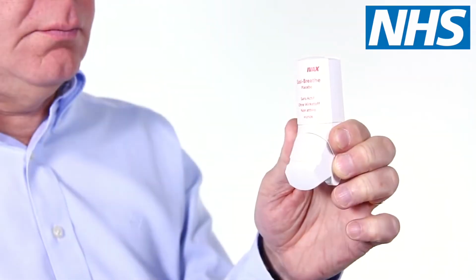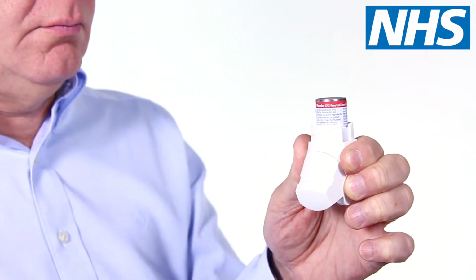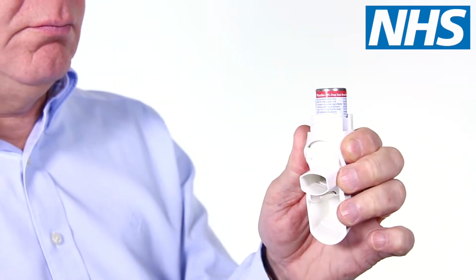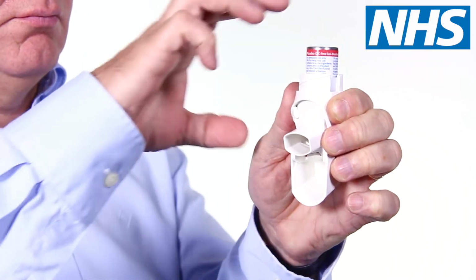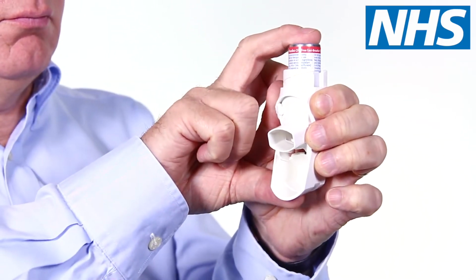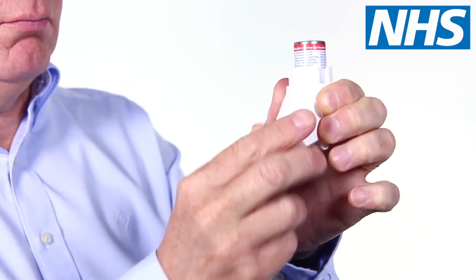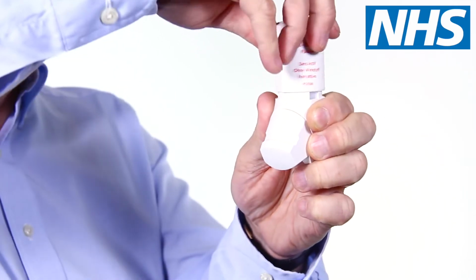To test spray your inhaler, unscrew the top of it so you can see the metal can inside. Open the cap. Shake the inhaler and spray the aerosol into the air by pressing the can with your finger or thumb. Close the cap and put the top back on. Your inhaler is now ready for use.